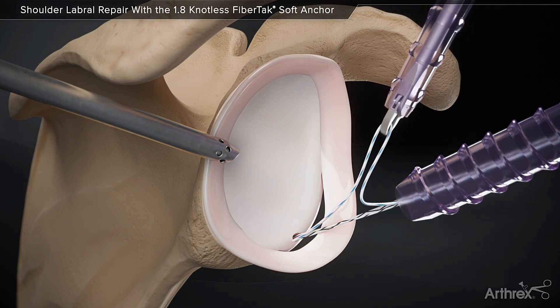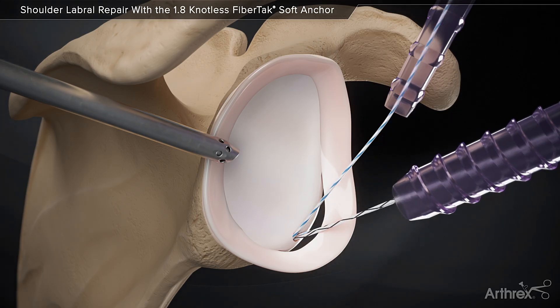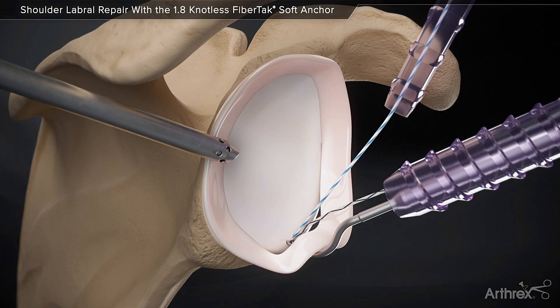Retrieve the repair suture through the anterosuperior cannula with a suture retriever. Using a quick pass suture lasso, pass a nitinol wire loop through the labrum.